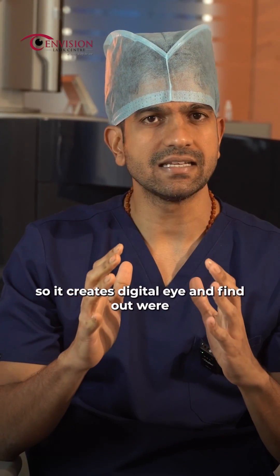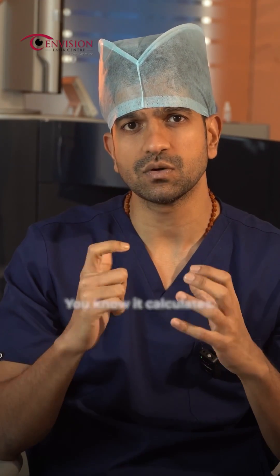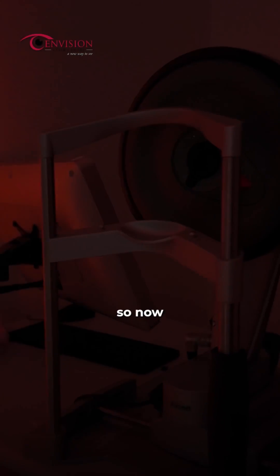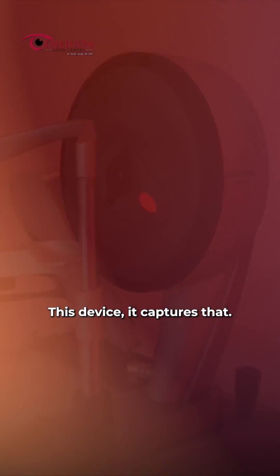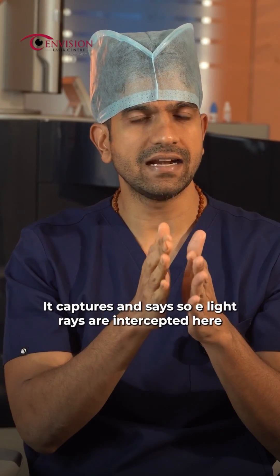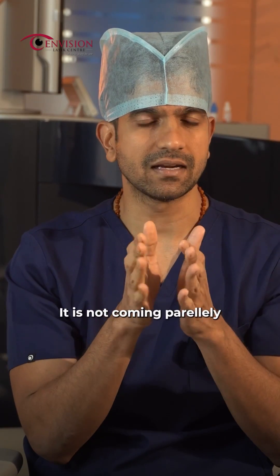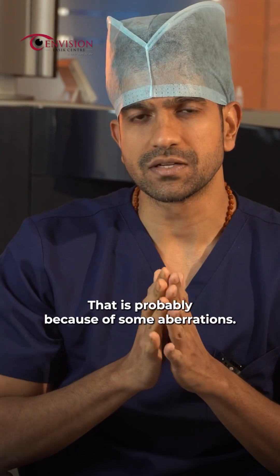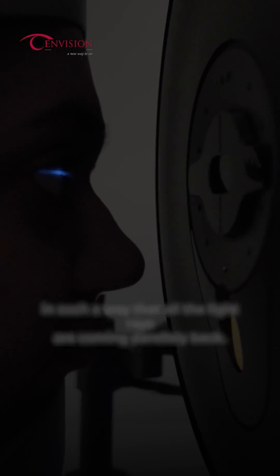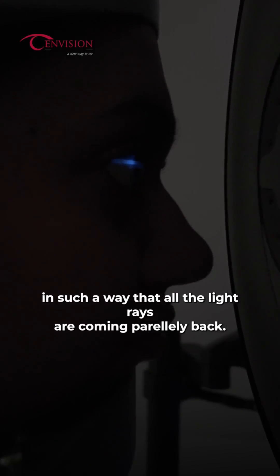When we create this digital eye twin, it calculates. The device captures the light rays and detects that they are not coming back parallelly — probably because of some aberrations. It then sends light rays again in such a way that all the light rays come back parallelly.